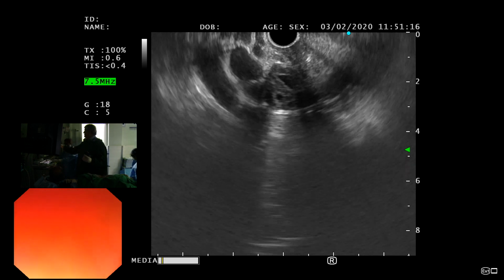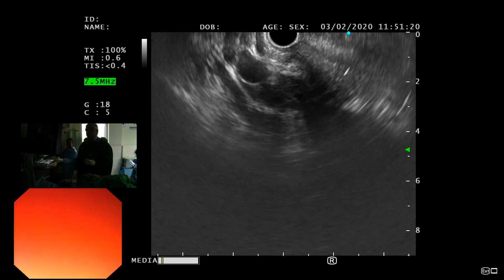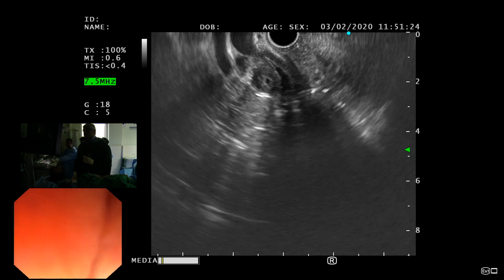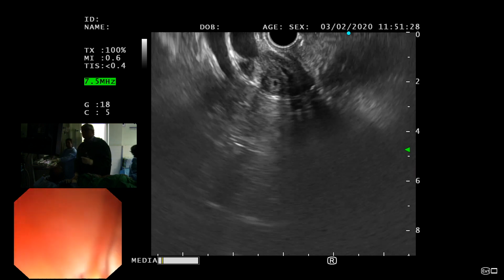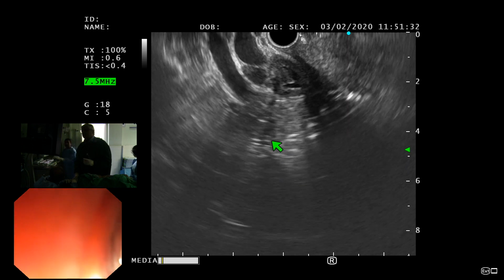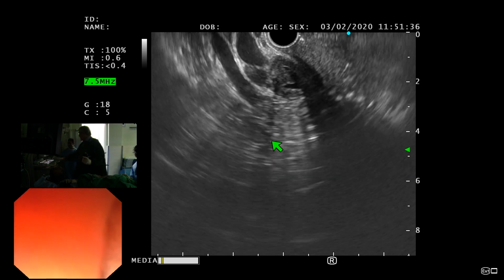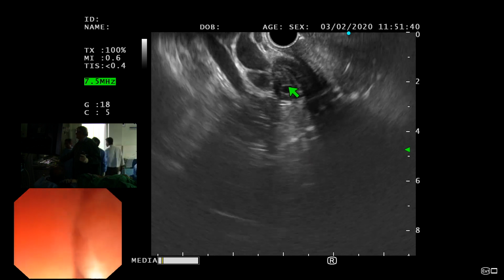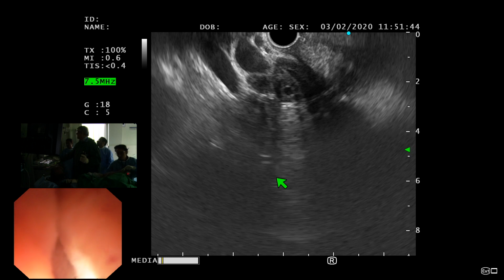Yeah, can you follow that duct somewhere? Yeah, I'm just going to. This whole area is very. And there is what? You see there. Where is the stent? There's no stent in that area. Stent is just above this. Okay, let me show you. No, what I'm saying is, Khalid, do you see this duct? I see that area. Yeah, that to me is, and I'll show you flow as well.